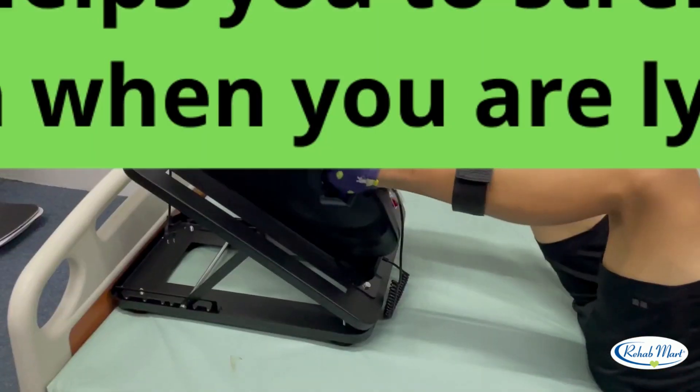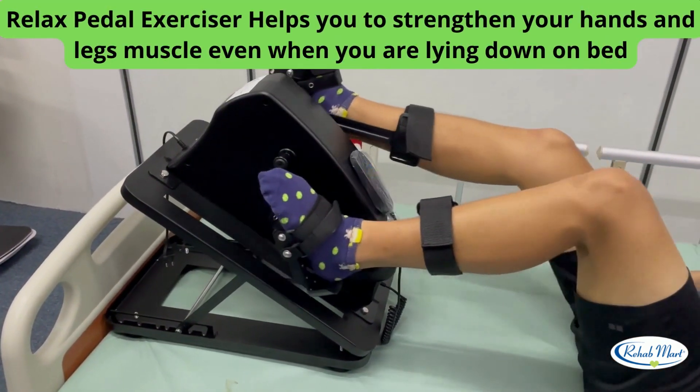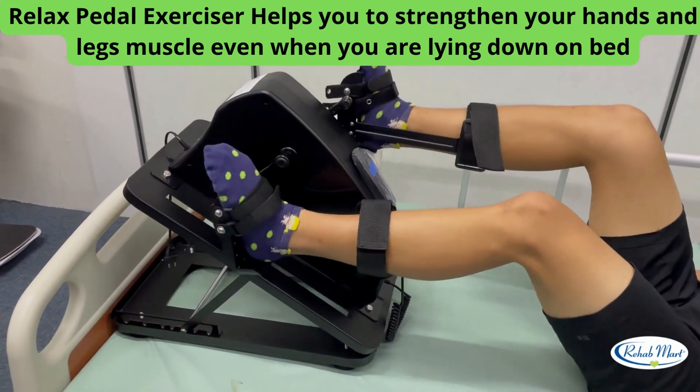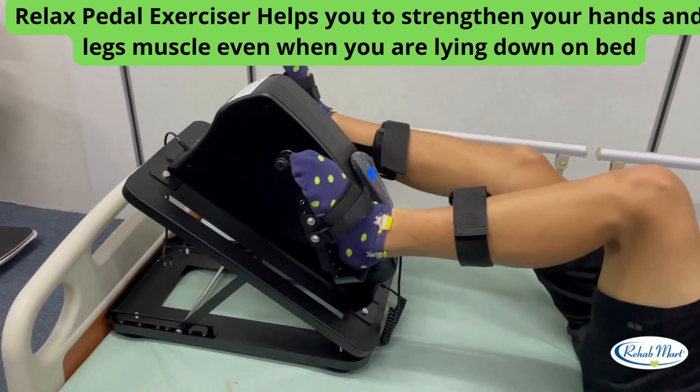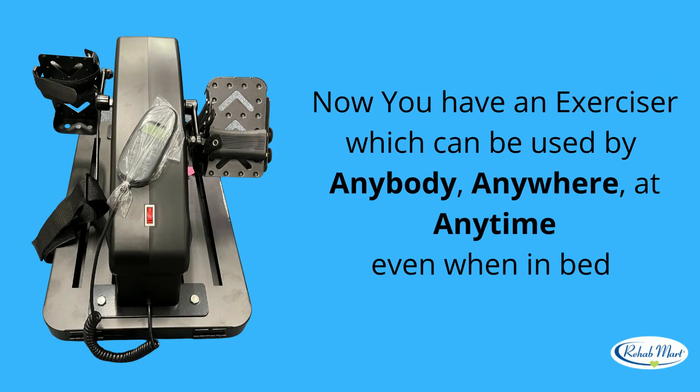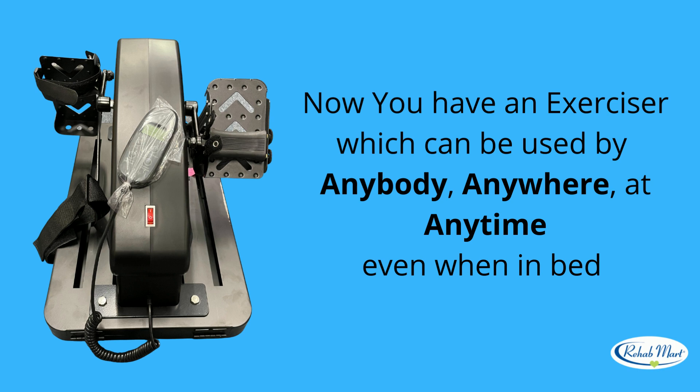Who says you cannot exercise in bed? Relax Pedal Exerciser helps you to strengthen your hands and legs muscles, even when you are lying down on bed. Now you have an exerciser which can be used by anybody, anywhere, at any time, even when in bed.